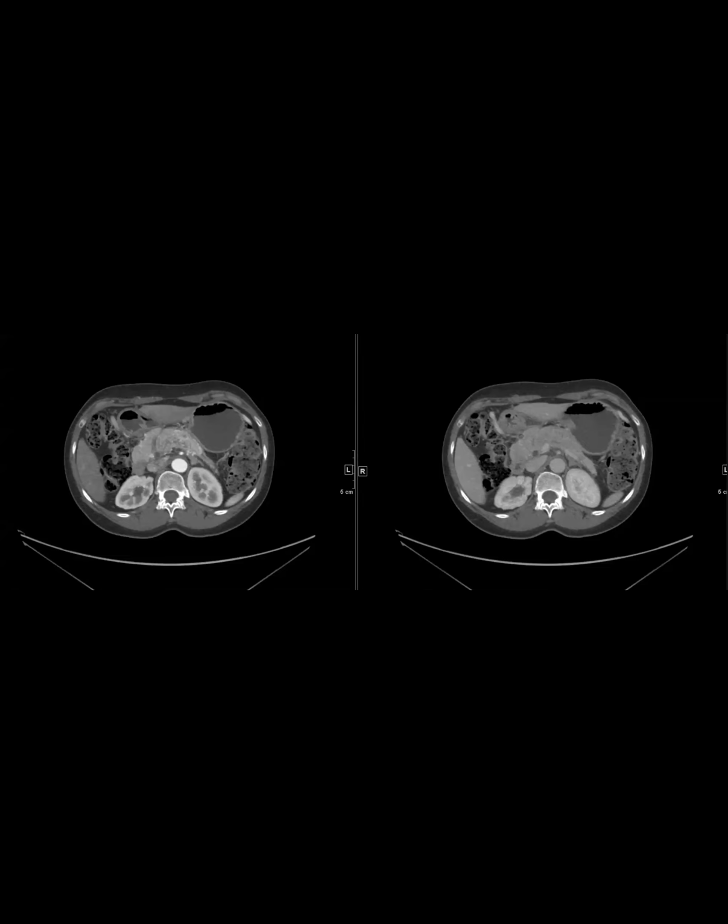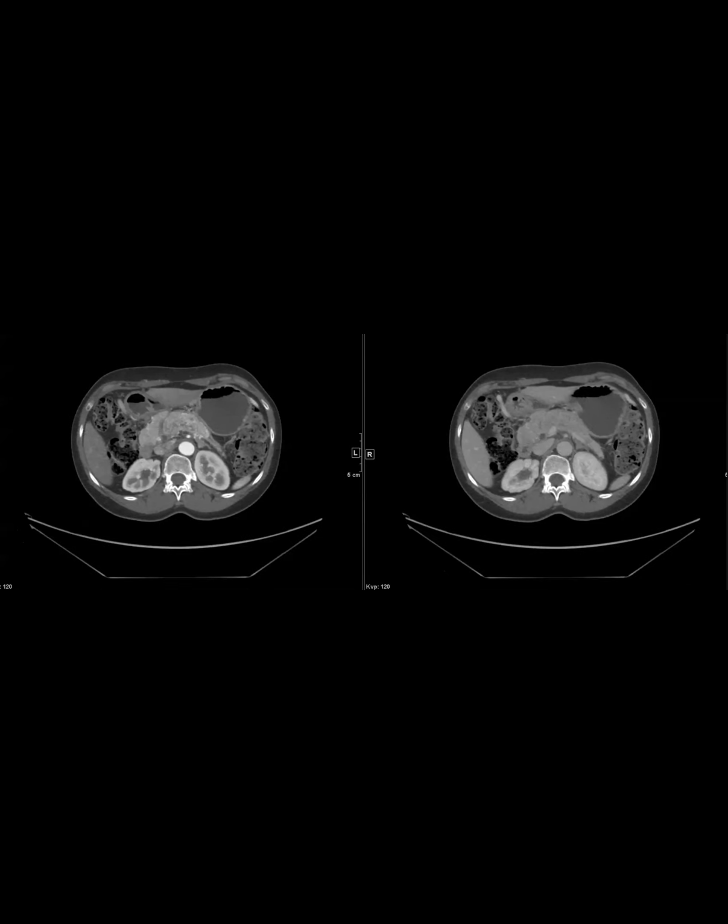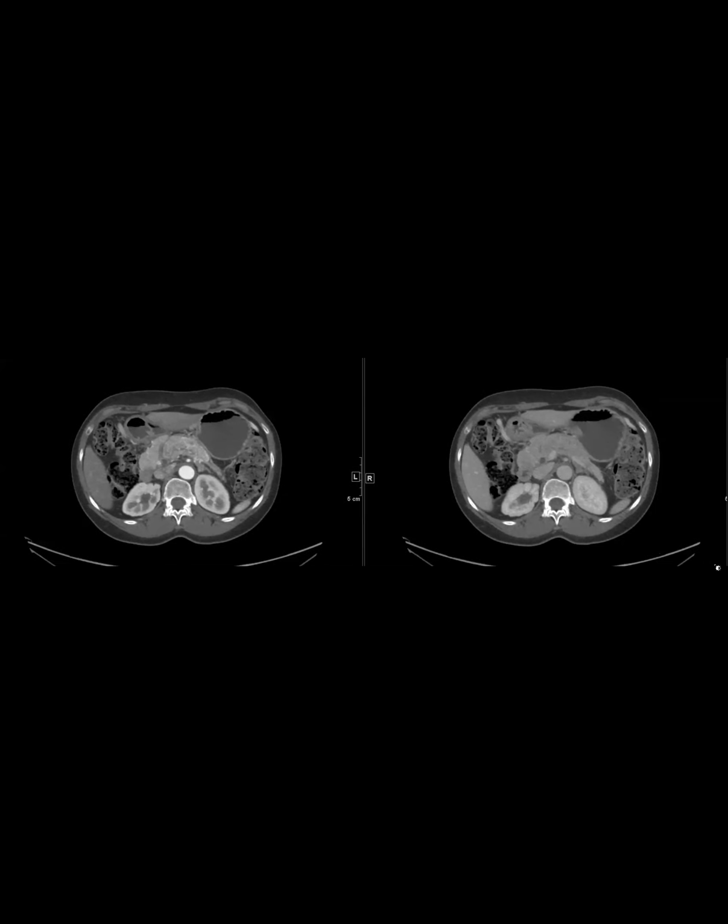It's a LI-RADS question, of course. If you have a nice arterial phase on a recent exam and it shows arterial phase hyperenhancement, but you don't have a good delayed phase, and then you have the next exam, the arterial phase is all motion-degraded. Can you add together those exams provisionally and say, we think this still has arterial phase hyperenhancement? Right. So it's a fantastic question.